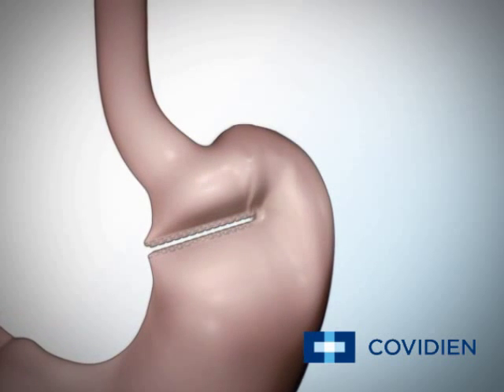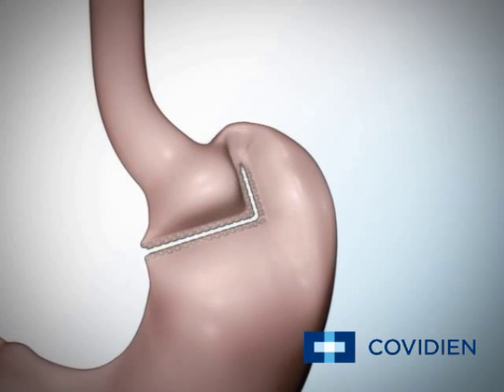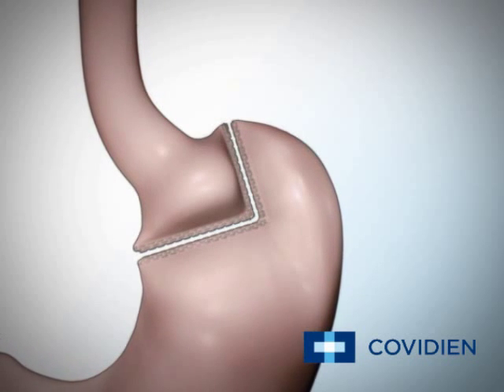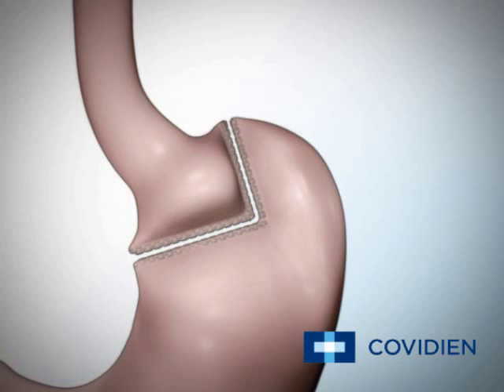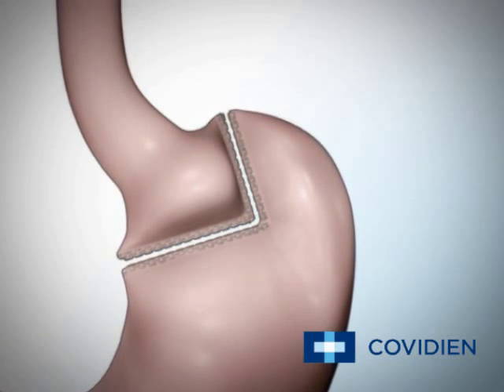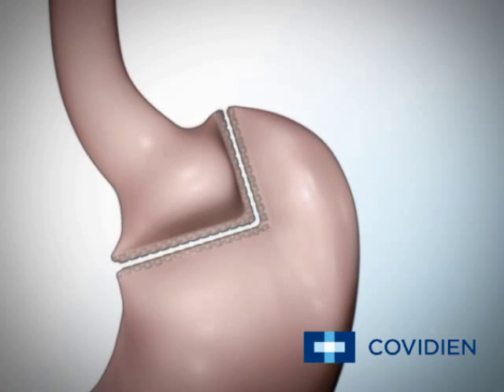Your surgeon starts by using an endoscopic stapler and divides your current stomach about one to two inches below the area where your esophagus connects to your stomach. The smaller upper section of the stomach that is connected to the esophagus is your new stomach, also known as the gastric pouch. This gastric pouch will hold about two ounces of food.